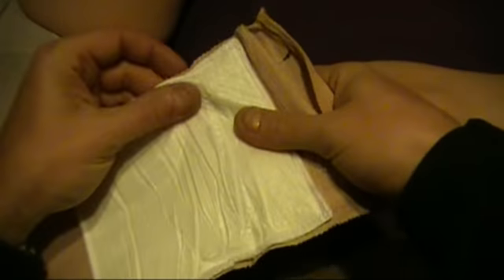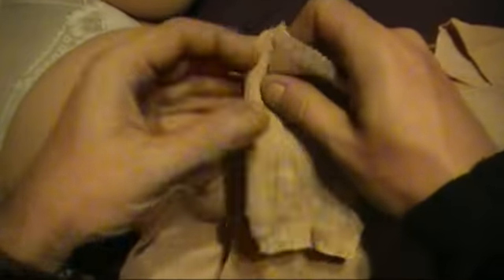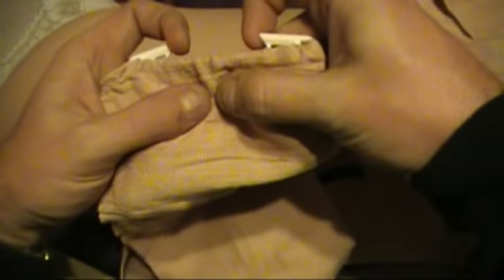What this one is, you have an absorbent pad and some Velcro. And then you have a huge amount of wide ace wrap. And then over here, there's the little clippy things. So if I was kneeling on it, I'd pick up my knee, put this on it, and kneel on it again. Now, unwrapping this was a dumb idea. I was just doing it to show you, because if it's all bundled up, it's easier to negotiate.